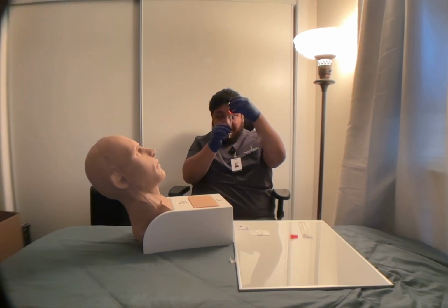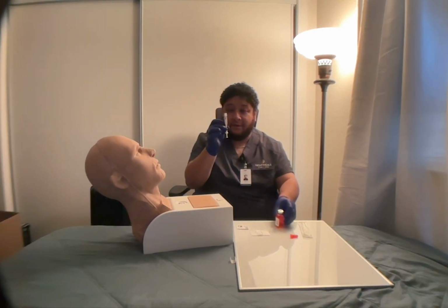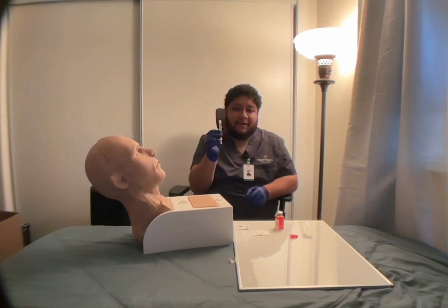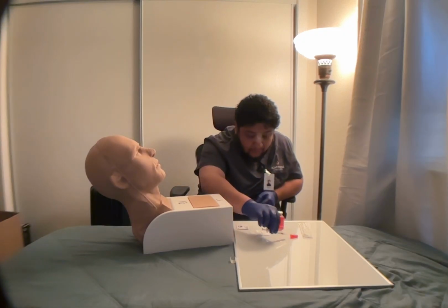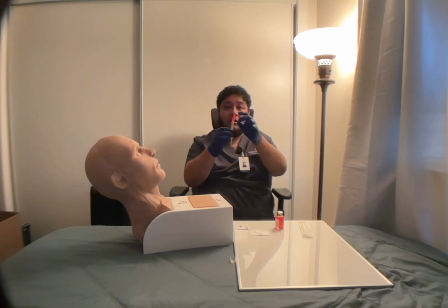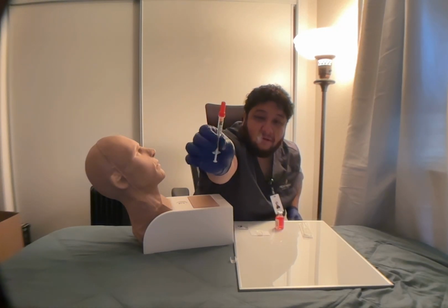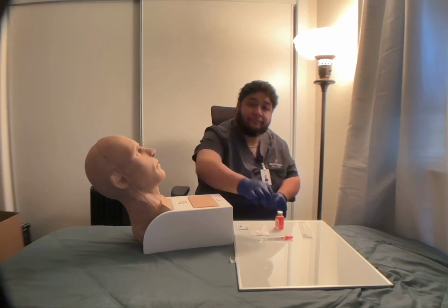Okay. Check for any air bubbles. No air bubbles are present. If there are, you're going to go ahead and tap and push out any bubbles if there's any present. Now I'm going to go ahead and do the swoop motion or method. Alright, there's my 0.1 milliliter of medication. I'm going to set this down.